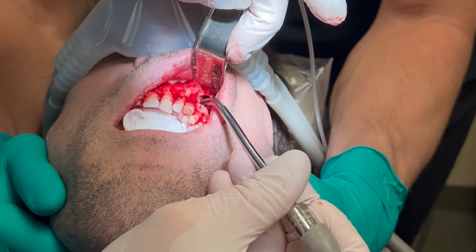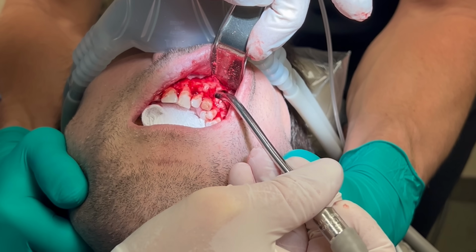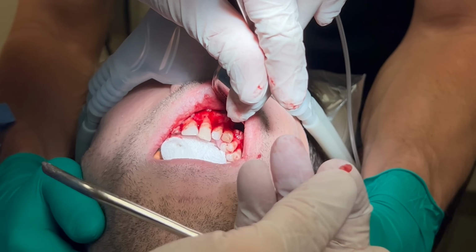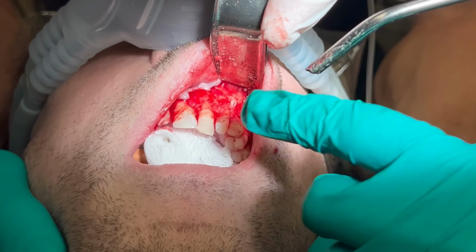To avoid this, I expand the extraction socket so I have more access to this root. I gently use the suction to manipulate the root back into the extraction socket, and eventually I'm able to retrieve it. This is a huge relief and saves a much larger procedure. There is a communication with the sinus, which I'll address later in the surgery.